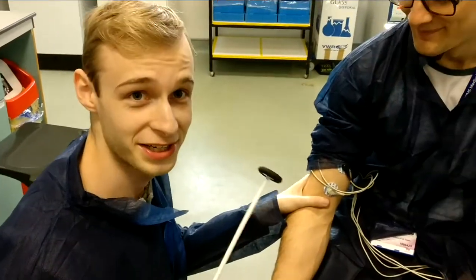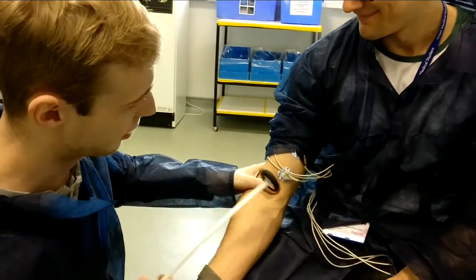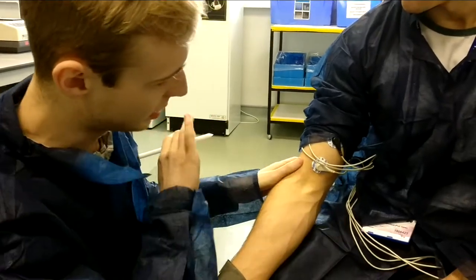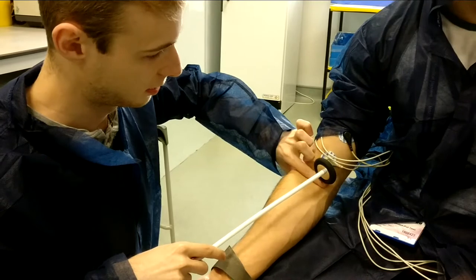Okay, so I'm gonna try and elicit Tom's biceps reflex. I can feel with my thumb here where the tendon is. It's running along here. I'm actually gonna use the back of my forefinger here. So it doesn't hurt? Yeah.